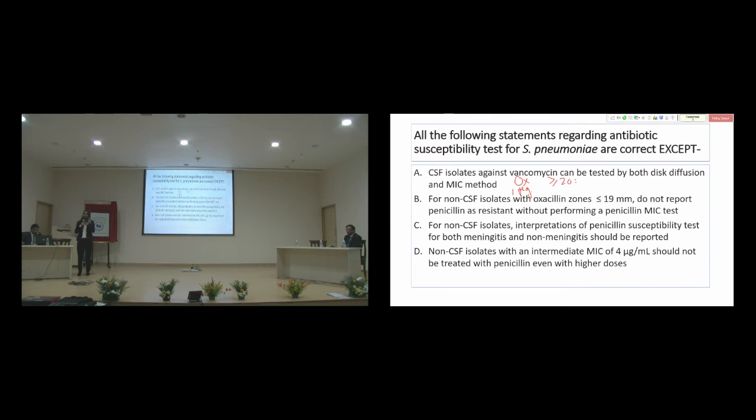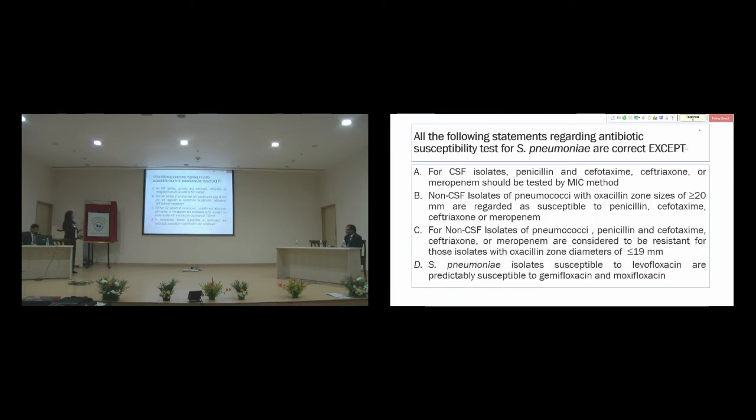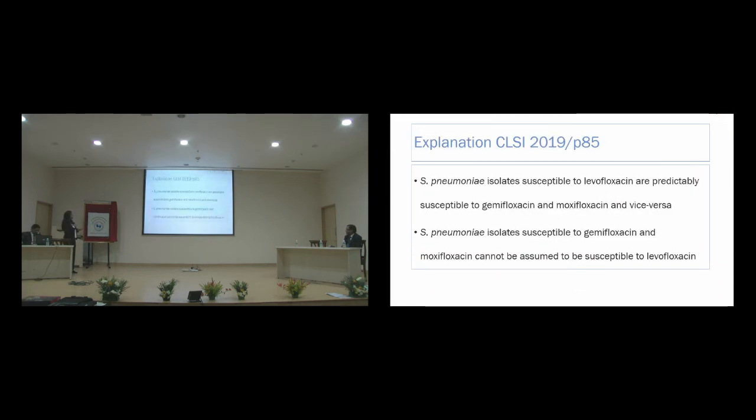Okay? If it is 20 and more, you can report it as sensitive. If it is sensitive to oxacillin, it indicates that it is sensitive to ceftriaxone, cefotaxime, meropenem. These are the drugs it is sensitive to. If it is resistant, you have to do the individual antibiotic MIC tests. So I'll show you the explanation, then we'll come to the question.